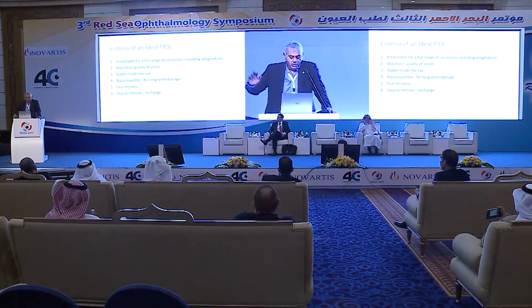Today, we're not in the era of large incisions, suturings, and removing of suturing 3 weeks later. And I want a lens that is easy to be removed, because we know that the majority of the lenses that we are putting today are going to get removed 30 years down the road when these patients develop age-related cataract, because they are mostly myopes and high myopes. So the majority of these lenses are going to be removed. So you have to have this end in mind when you put the phakic intraocular lens today.